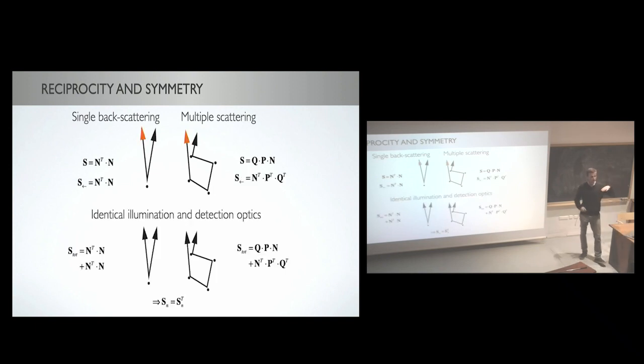But our imaging geometry uses the same single mode fiber to illuminate and detect light, right? So we are in a perfect backscattering direction. Our S and P scattering planes are not defined because we are normal to the sample. Which means that if you detect a photon going from one side to the other, we also have the counterpropagating photon, which reestablishes that the overall observed signal has to have this transpose symmetry. This is related to the weak localization of light, or enhanced backscattering.